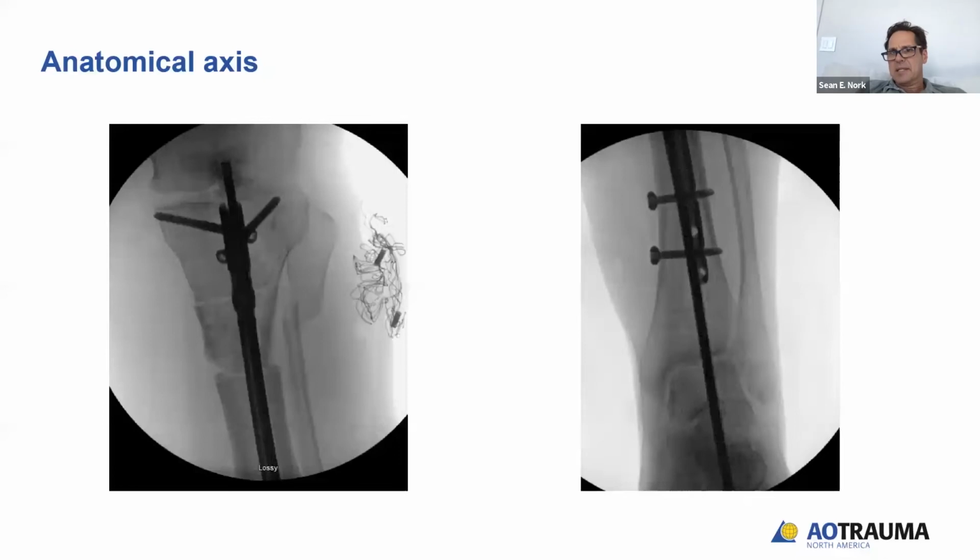One thing though, to Tim's points, I've done some pretty reasonable coronal plane deformity corrections with an intramedullary nail as an effective opening wedge.